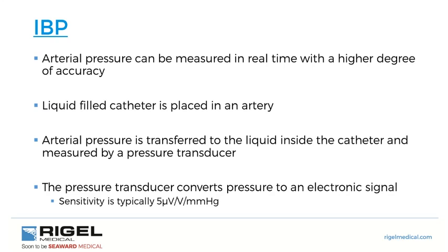So what the patient monitor is doing is it will output an excitation voltage, and the pressure transducer will proportionally put out a millivolt, which is proportional to the millimeters of mercury. So sensitivity is typically, for most patient monitors, 5 microvolts over the excitation voltage.